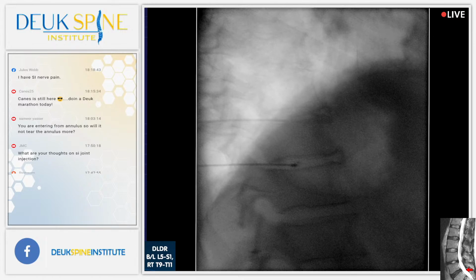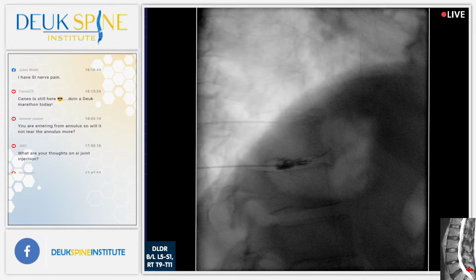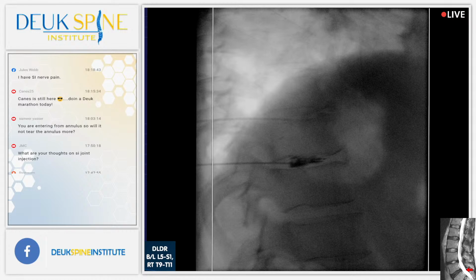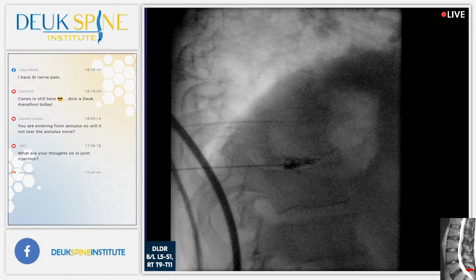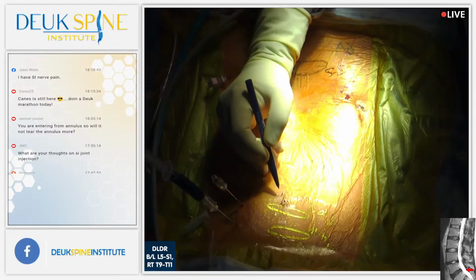How bad is that? What's your pain score? Give us a number. How bad is that on a scale of 1 to 10? Still a little sleepy. Can you give us a number? How high did it go? Is it a 10, 8, 9? 10. Is that where you get your back pain typically? Yes. 10 over 10 at T10-11, concordant.